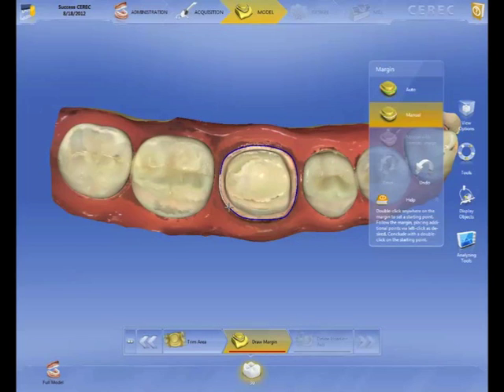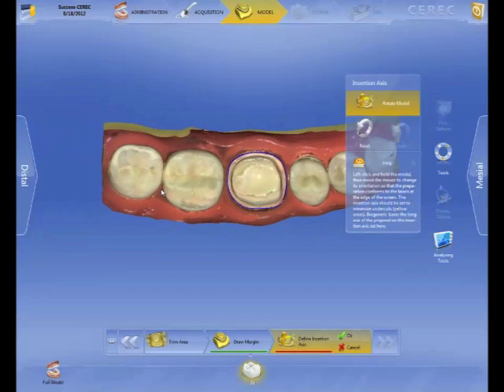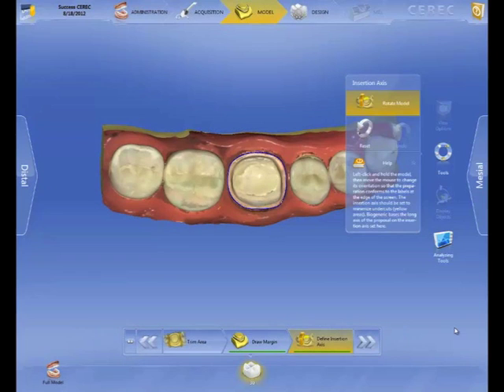Margination is the same way — although actually, think about it: having color here makes margination even easier because you can see the dentin and the enamel. You can see different color changes here, so this is going to really help enhance margination as well. Not that there was a problem before, it's just making it even better. Great innovation by Sirona.